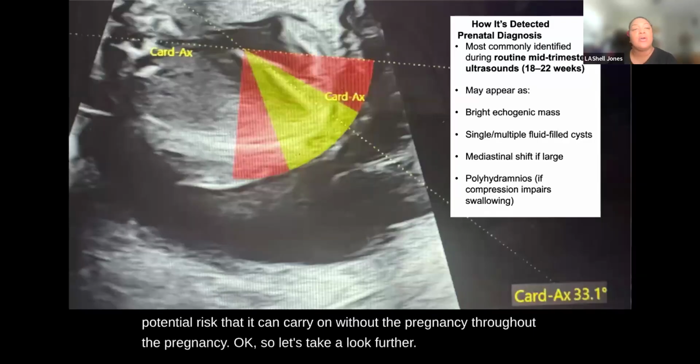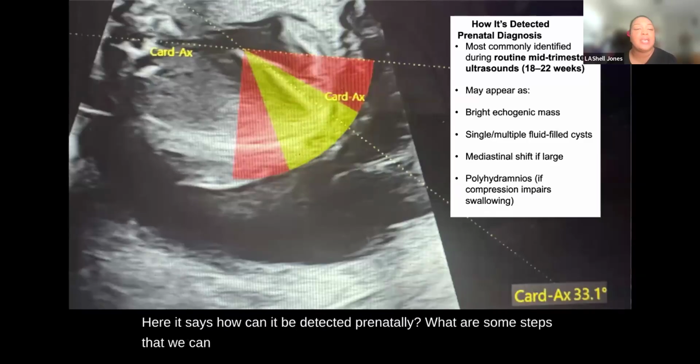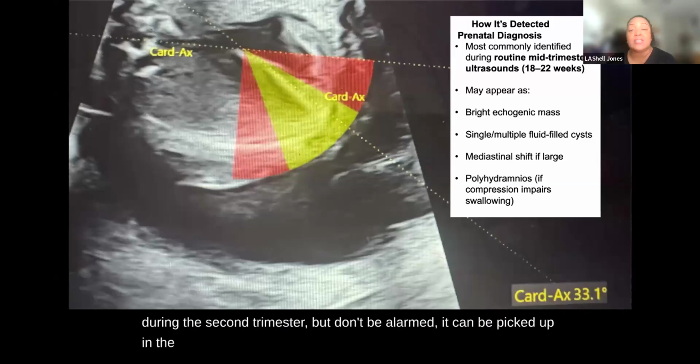Here it says, how can it be detected prenatally? What are some steps that we can follow in order to be able to detect this lung lesion? So right away, once again, I mentioned that it's most commonly identified during the second trimester, but don't be alarmed. It can be picked up in the third trimester as well. And it's going to appear as a bright echogenic mass.